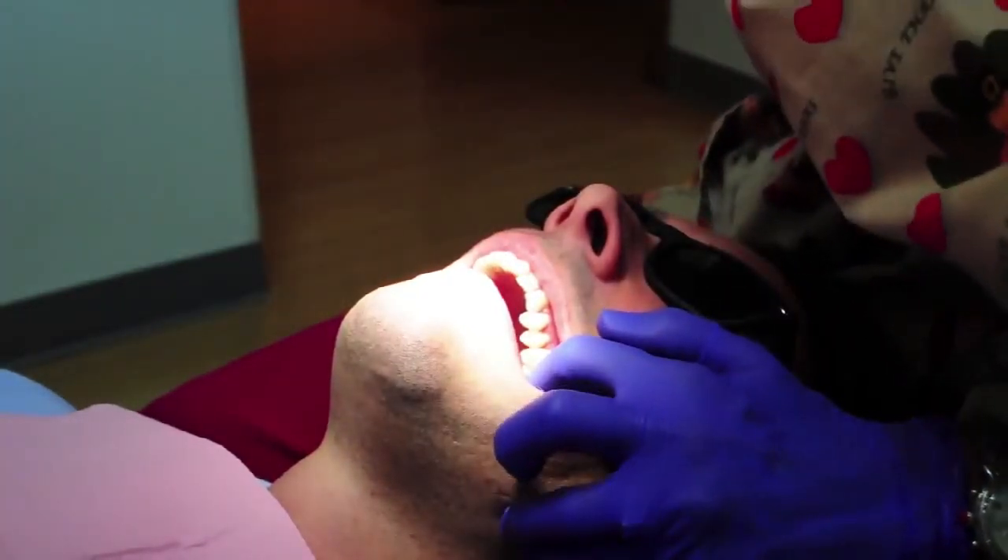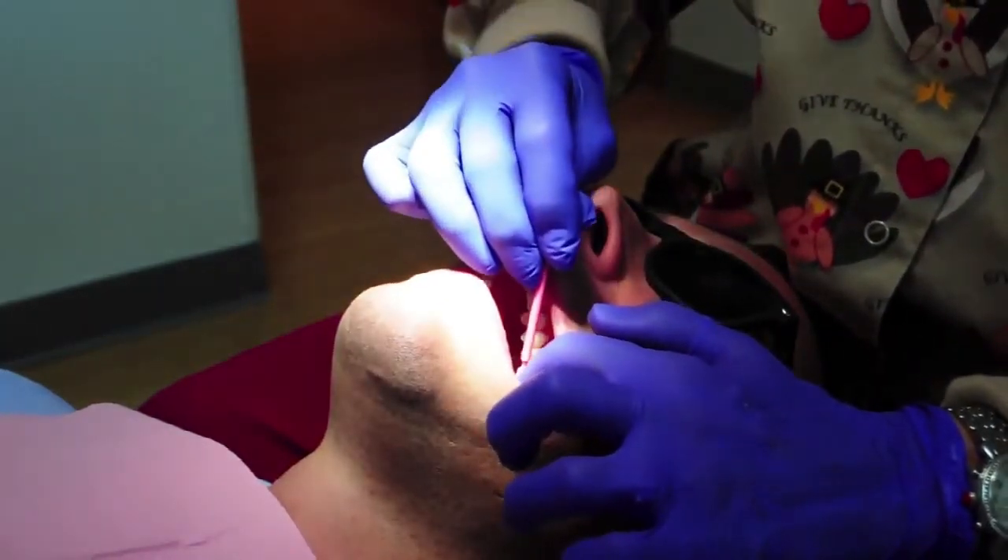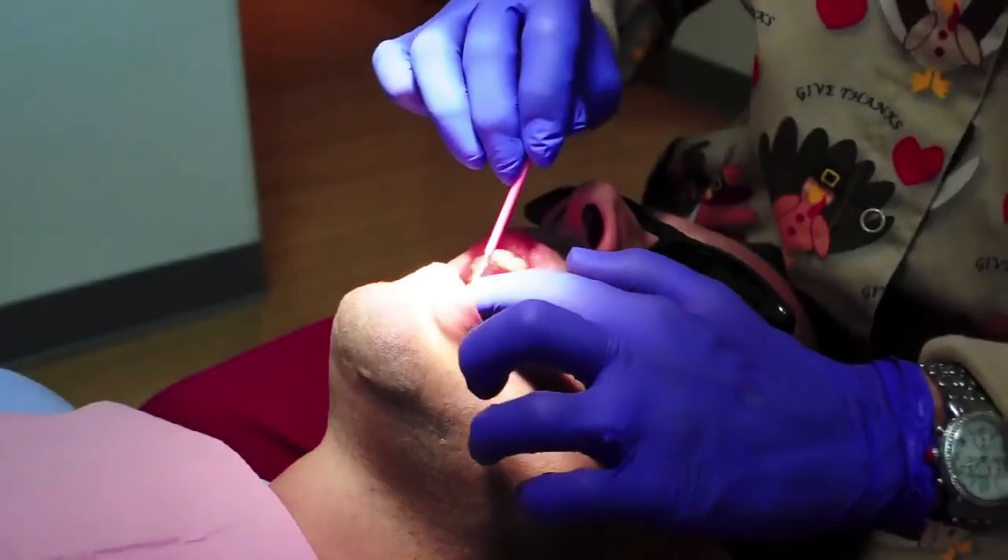Repeat this step for the lower arch — back molar to the central with one swipe. Keep the cheek retracted for three seconds, or ask the patient to breathe through their teeth, quickening the set.